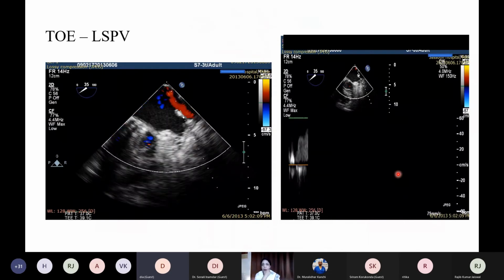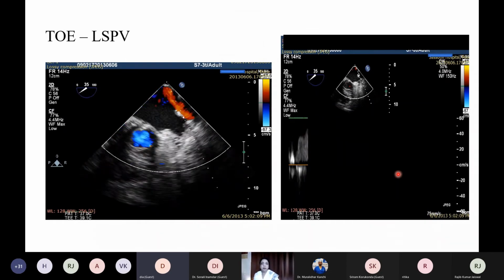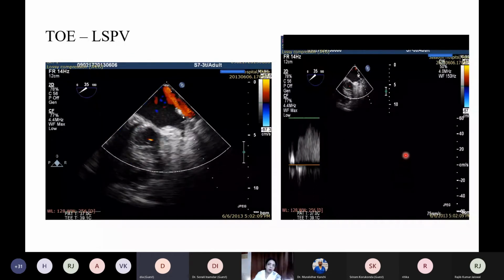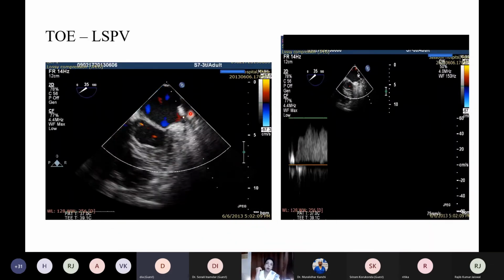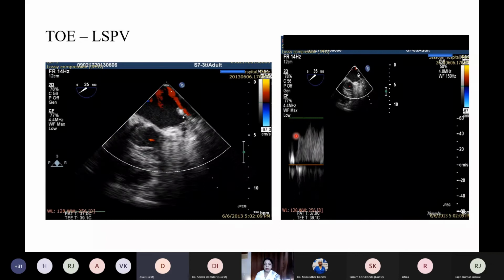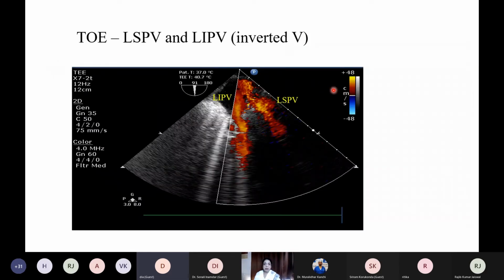This is the 4-chamber view. Actually, I have turned the probe a little bit to show you the left superior pulmonary vein. Beautiful positive wave. Fortunately, the pulmonary vein in transthoracic as well as in transesophageal, both are towards the probe, so there is no confusion. Both are positive waves, red color. And see how beautifully in this another video you can see S1, S2, D and atrial reversal. And this is the image showing this V, opposite V pattern of these two veins.